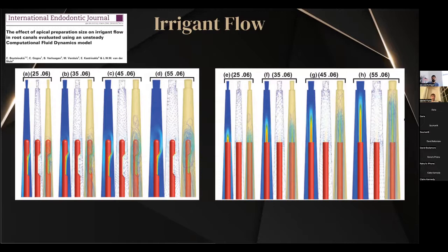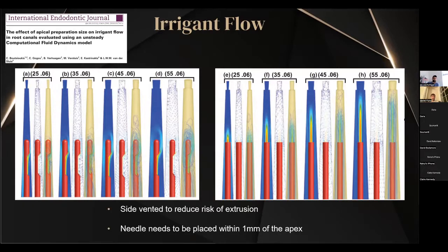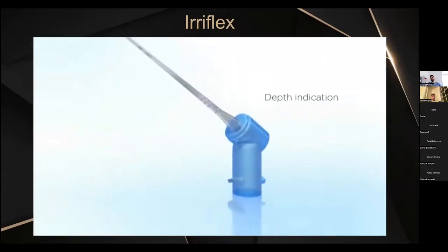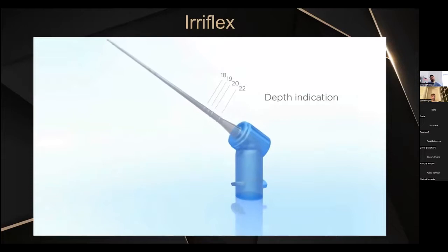So what this slide is showing is that side vented is essential to reduce the risk of extrusion, and really that needle needs to be as close to the apex as possible. The very easy way to get this done is Irriflex. Irriflex is probably my third favorite instrument that we have nowadays. First is my microscope, second is my AI motor, and third is Irriflex.